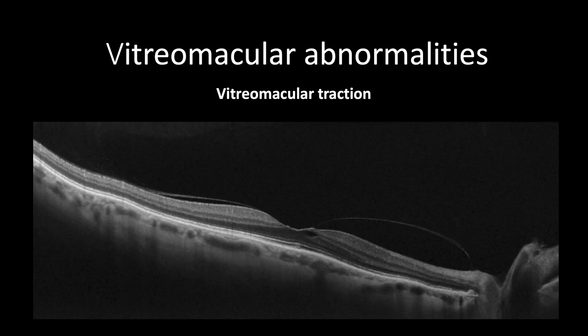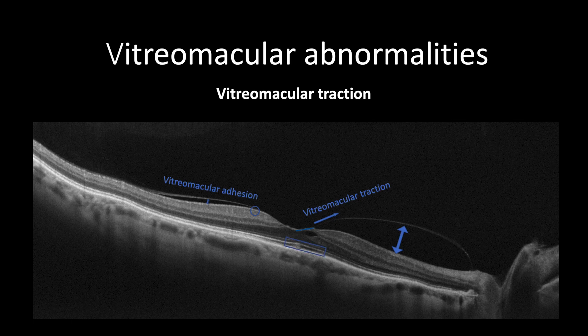As in vitreomacular adhesion, vitreomacular traction shows separation of the vitreous perifoveally, but with vitreomacular traction at the center of the fovea in the form of a plate, showing anterior-posterior and oblique posterior cortical vitreous traction with disruption of the ellipsoid zone, interdigitation zone, and inner retinal tissues.